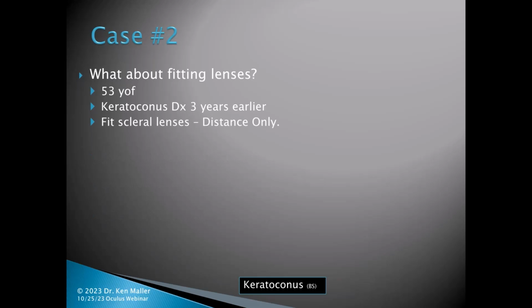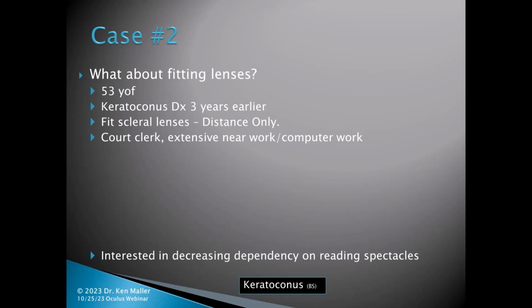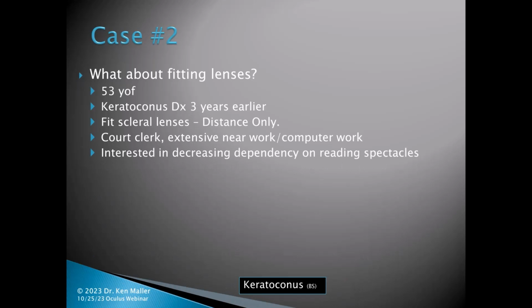Anyhow, she came in at that point, and I had fit her for a distance-only pair of sclerals. Well, she's a court clerk, and she does an extensive amount of near work and computer work. So when she was in for her annual exam this particular year, we were talking about replacing the lenses, and she asked me if she could get a pair of scleral lenses that would decrease the dependency on the reading glasses that she'd been using for the past 3 years.